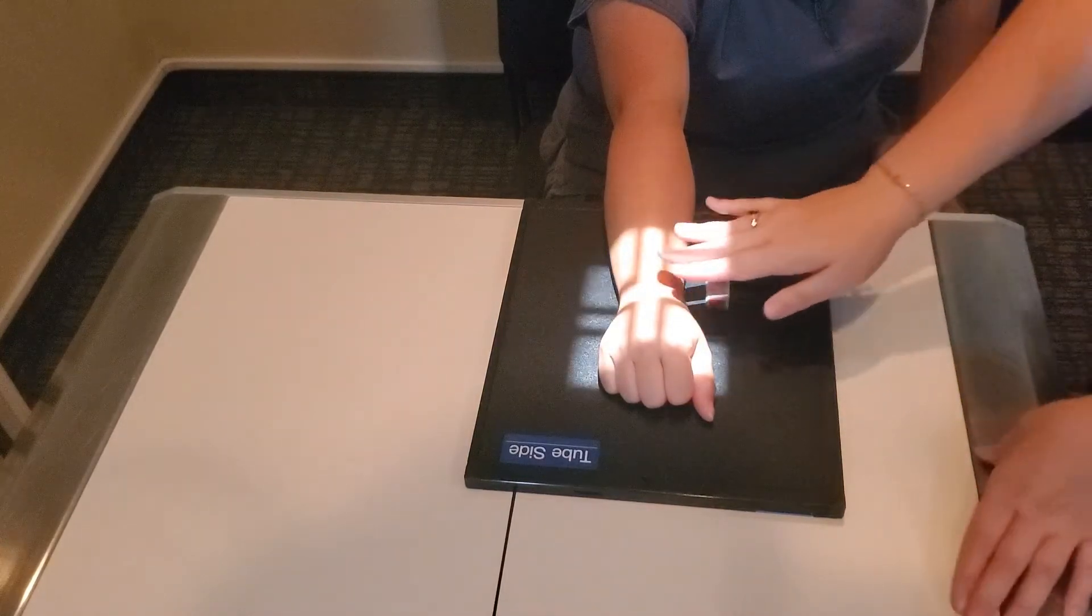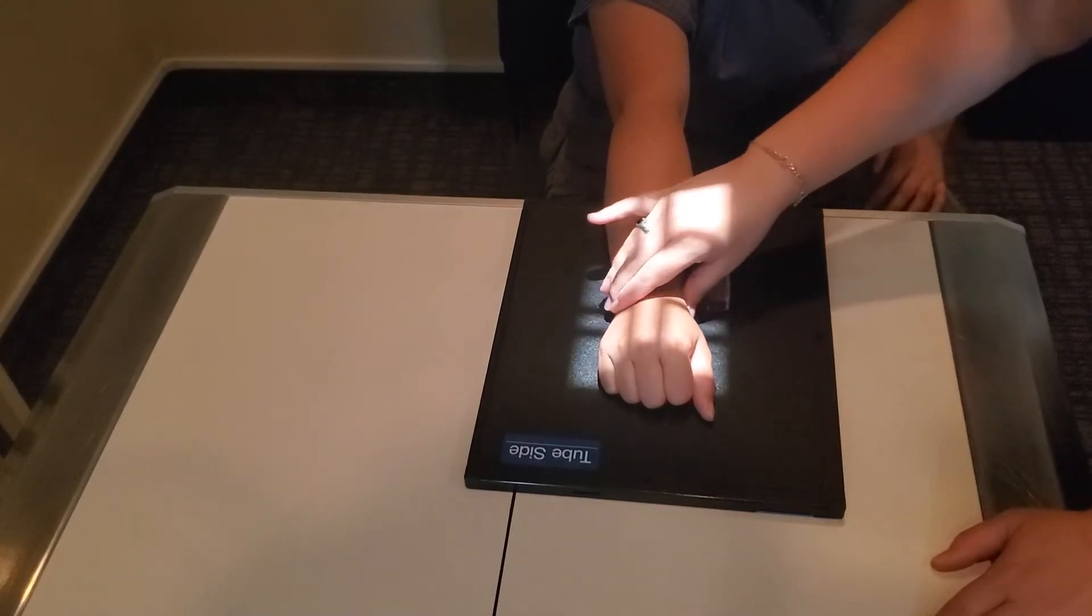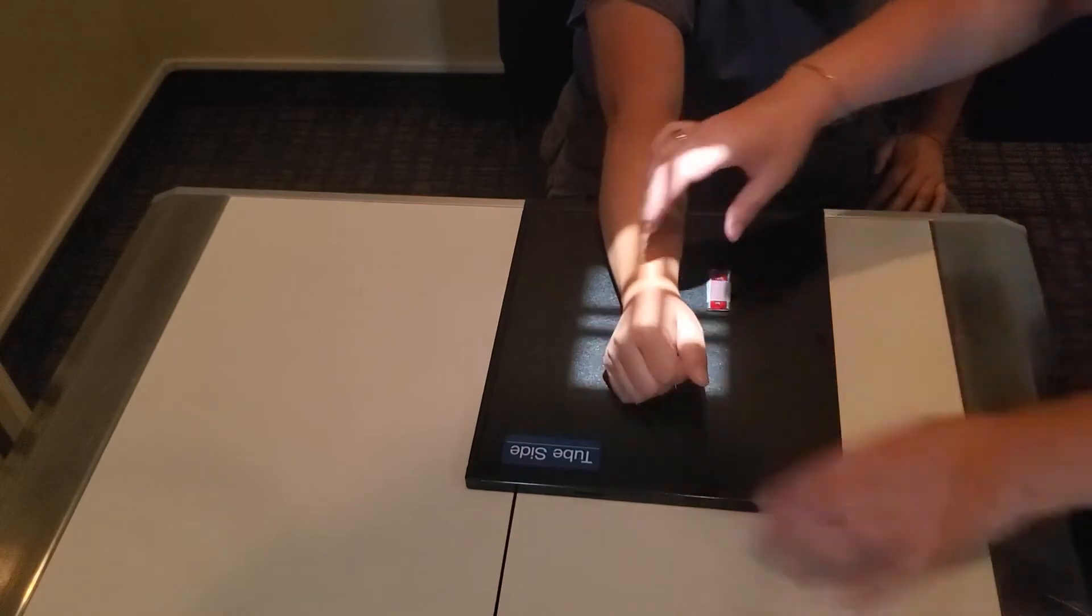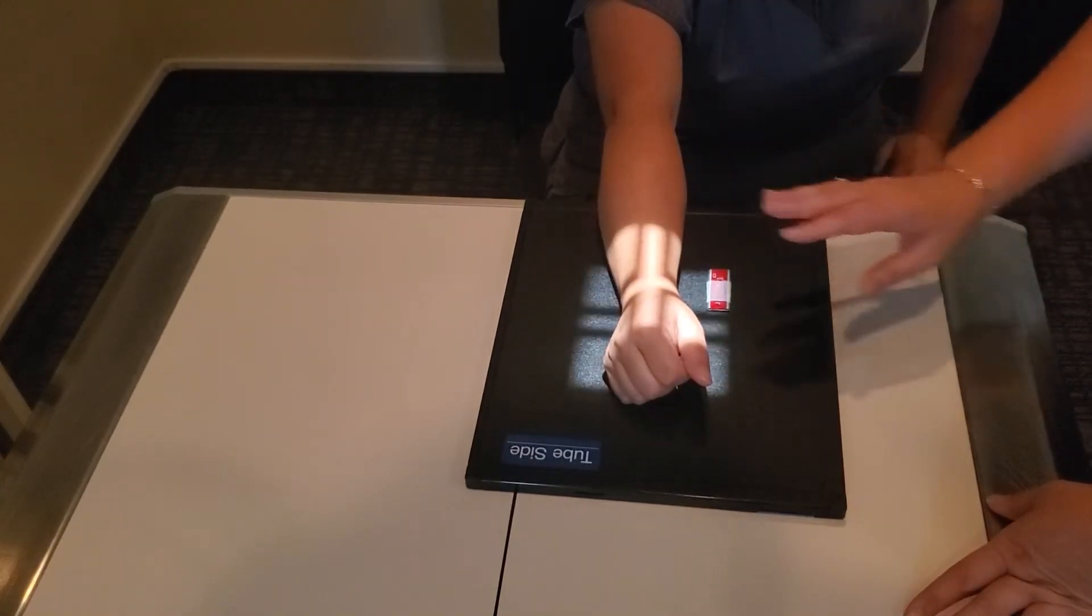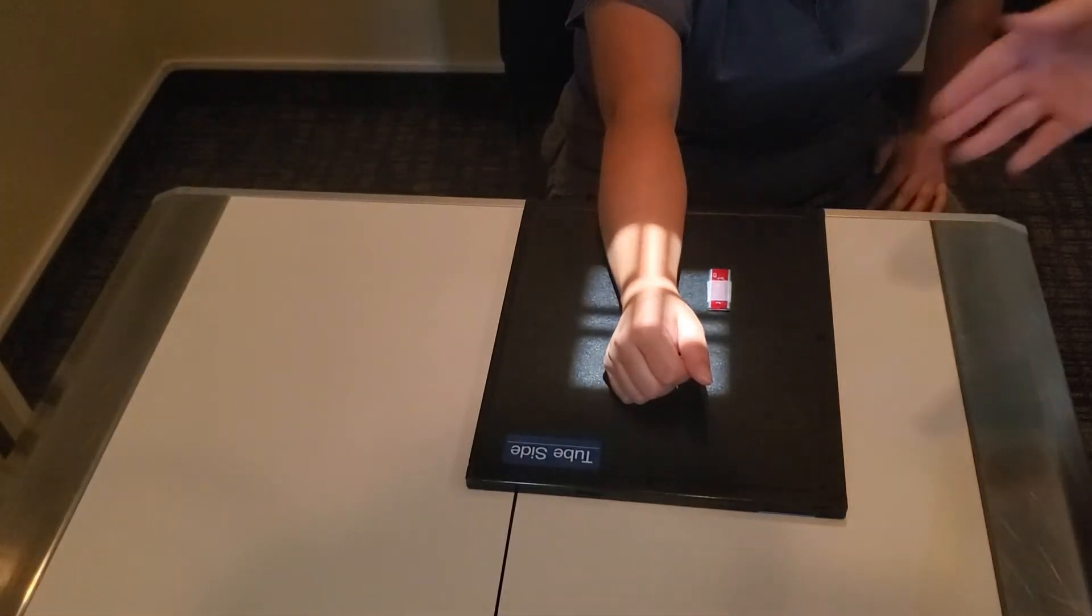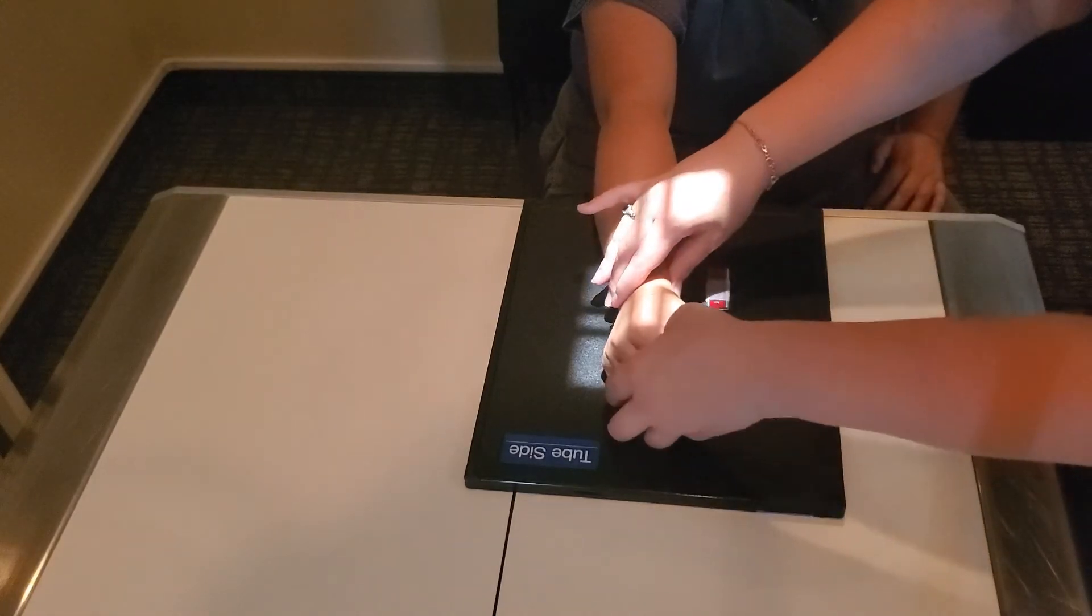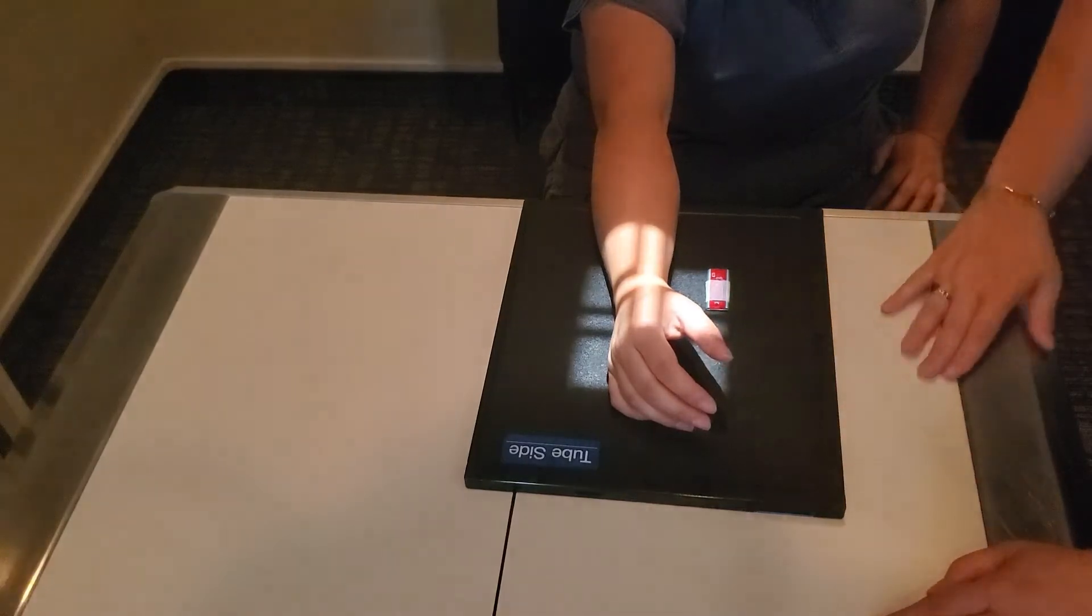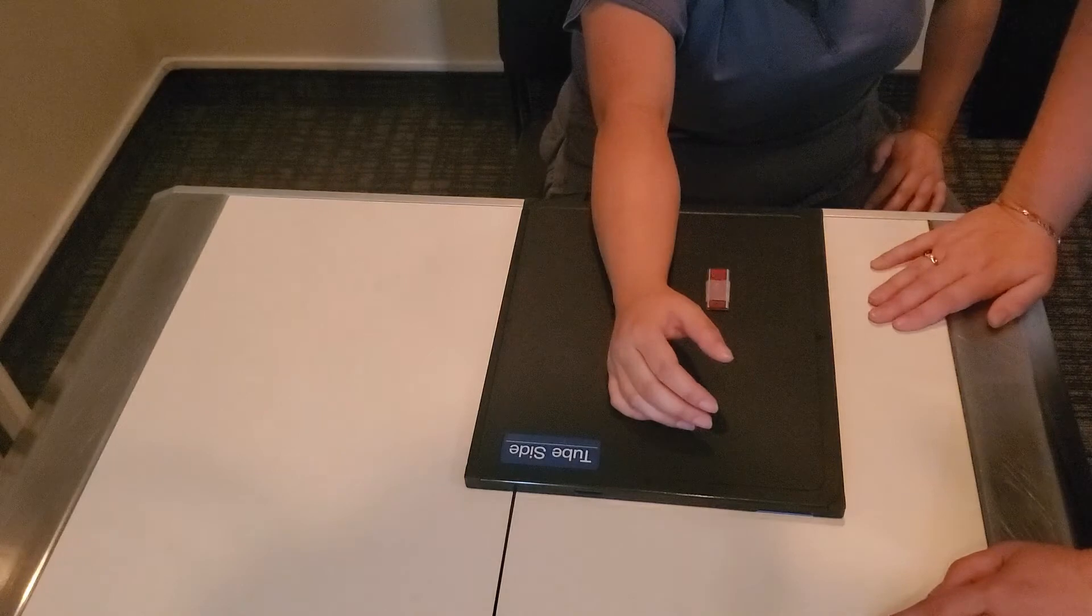So right now our PA wrist that's you know just a little thick. When I go to my PA oblique so now I'm just rotating to 45 that's a little bit thicker that's why we go up to 57. So in this image again we're just rotating to 45 degrees centering to that mid-carpal area but everything else is the same. If the patient wanted to for comfort they could un-clench their hand a little bit to rest their hand if that was more comfortable but again 57 at 2 for this image.